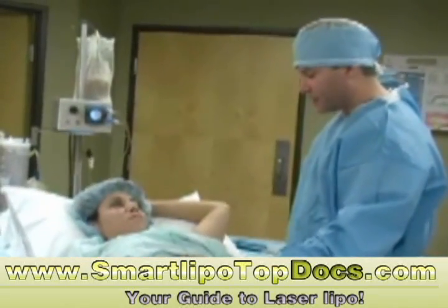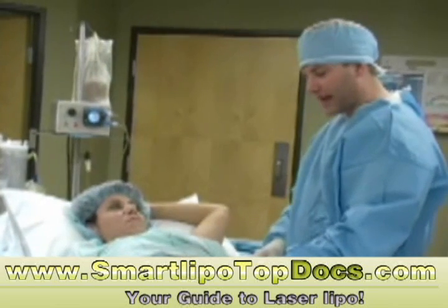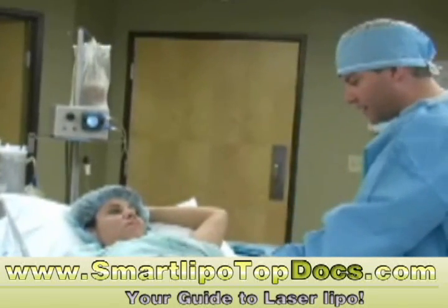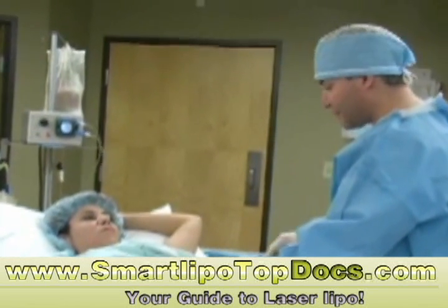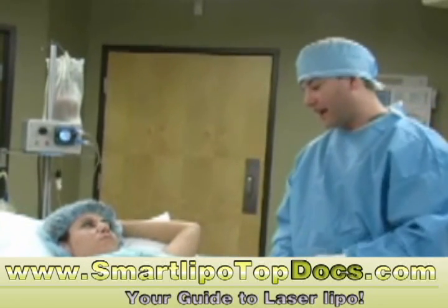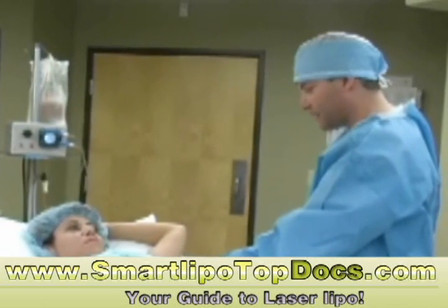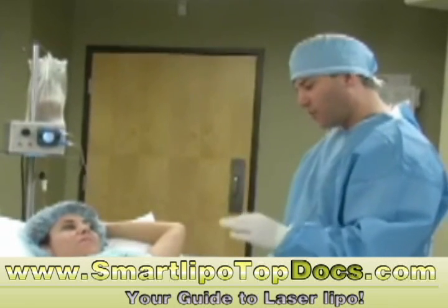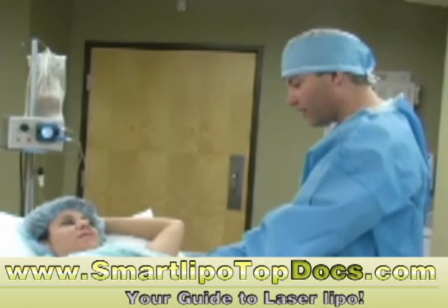Here at Infini, we mainly use this tumescent technique with very small instruments. We do have other modalities like laser and ultrasound in our clinic, but we only use those modalities — those liposuction helping tools — if we absolutely need them. They've never been proven to provide any definitive evidence of improving your end result of liposuction. Sometimes they can make things easier for the doctor if we're having a problem removing fat in a particular area. Someone like you who's never had previous liposuction — I can feel right now that your fat is nice and soft and easy to work with — we're not going to need any tools. Just pure, small instrument liposuction. You get a maximum amount of skin retraction by using the small instruments, and you're going to do very well with that technique.